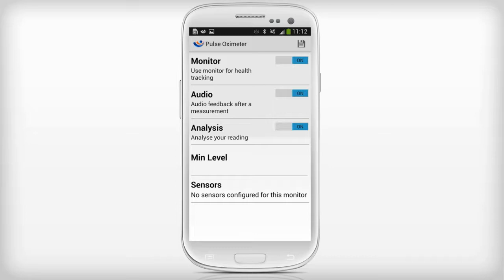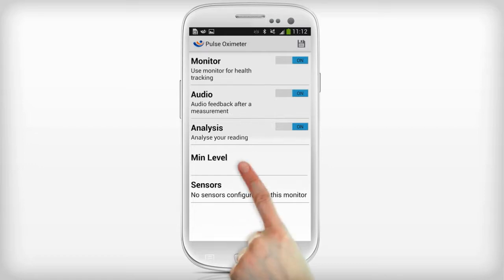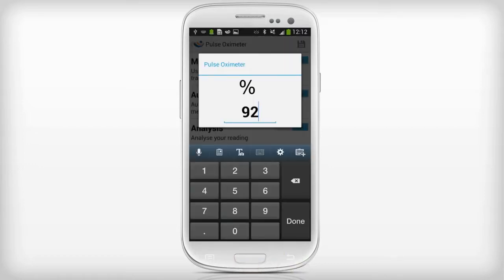If you set the analysis on, you need to enter maximum and minimum values. For the pulse oximeter, click on min level and enter the minimum level.